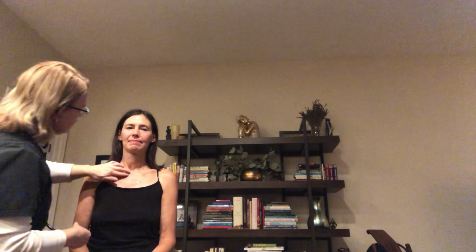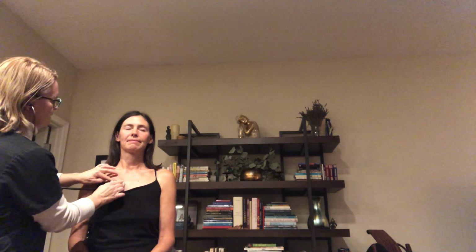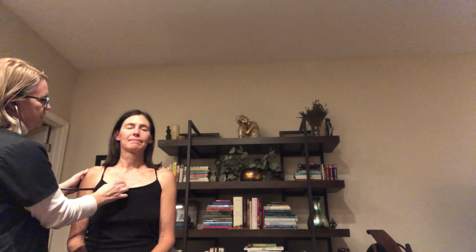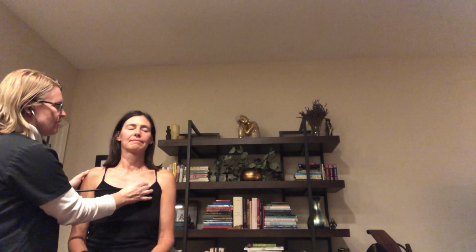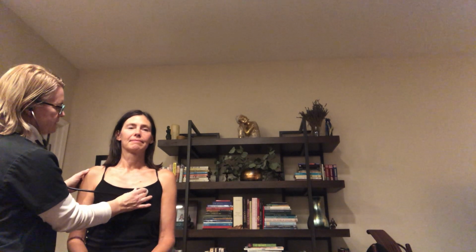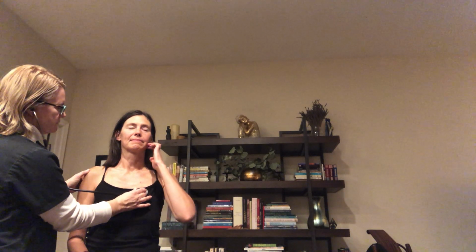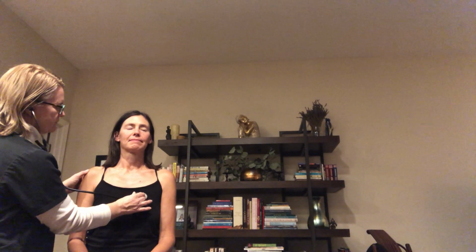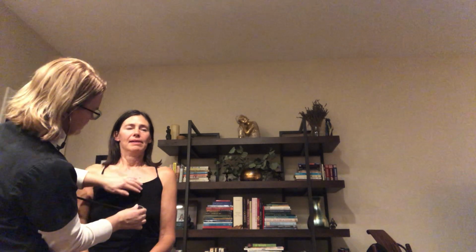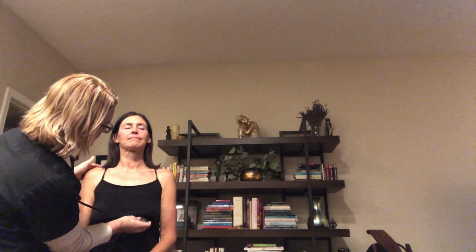exam for the heart. And so we're going to do 5 points. I'm going to start with the aorta, and I'll be listening. Okay, she can just breathe normally here. So I'm going to be listening to the heart. And then the pulmonary valve. Erb's point. Tricuspid. And then the mitral, so that's going to be midclavicular down to the midline here under the breast tissue for female.